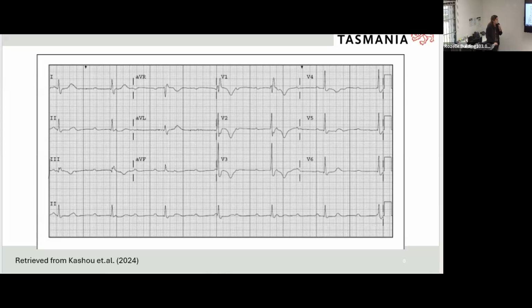So it's an interruption stopping the electrical. Yes, absolutely, Jazz. So we know that's where the block is occurring. And obviously we've been talking about the different sorts of patterns that we see in our different rhythm strips until now, but now we're trying to get a bit more specific about where exactly we're seeing these issues occurring. Yes, it's blocked. So could you show an example of an irregular complete heart block?